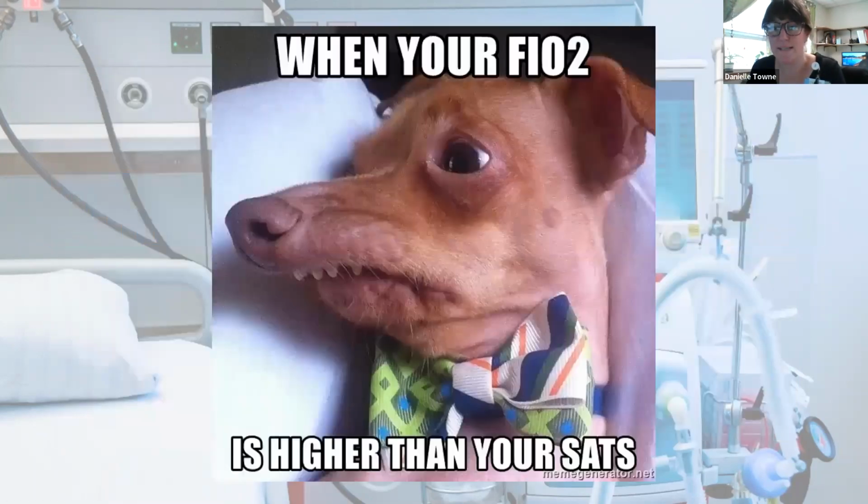FiO2. So we've got to set some type of an FiO2. Normal atmospheric FiO2 is 21%. We can administer anywhere from 22 to 100% FiO2 with invasive ventilation. And you just want to keep it as low as you can while maintaining a safe FiO2 for that patient.